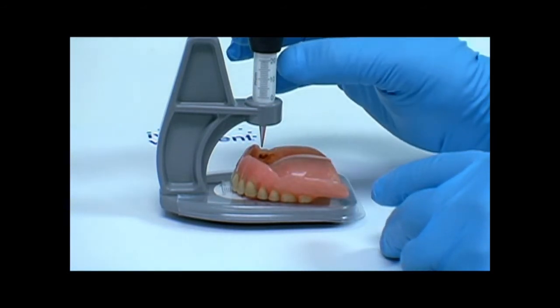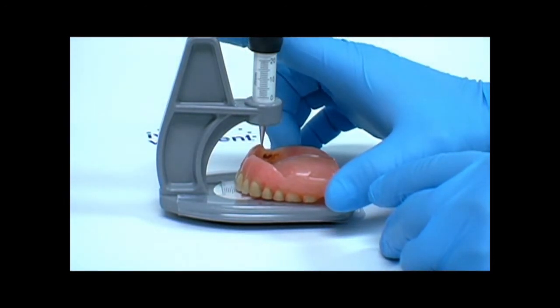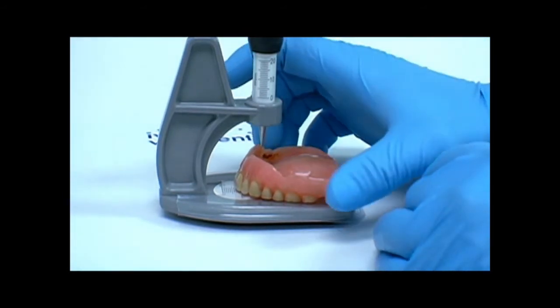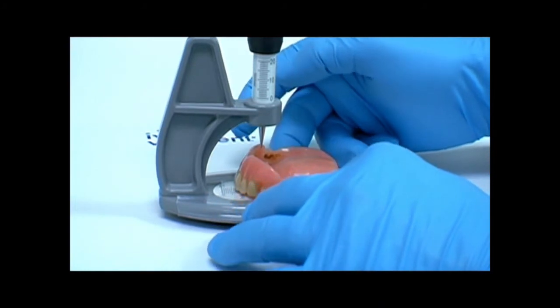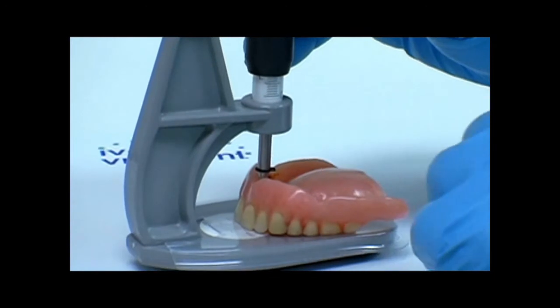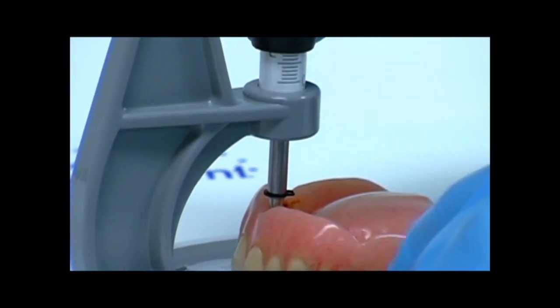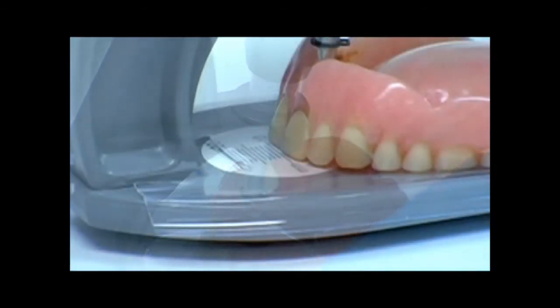So it's a wonderful means of communication for that one element. Another area that can be communicated to the laboratory is the labial positioning of the teeth. Again, I'm going to hold this in a steady position right into the center of the anterior papilla. And what I could do is read this measurement anteriorly, which I'm going to tip a little bit so we can see it in the camera perhaps a little bit better. And that measures around 10 millimeters.